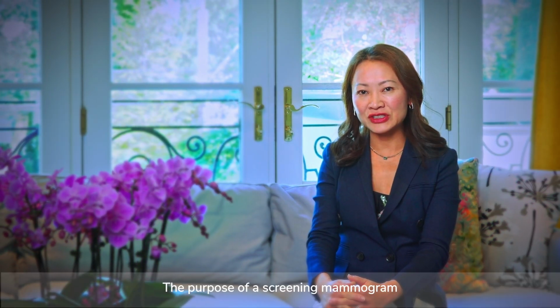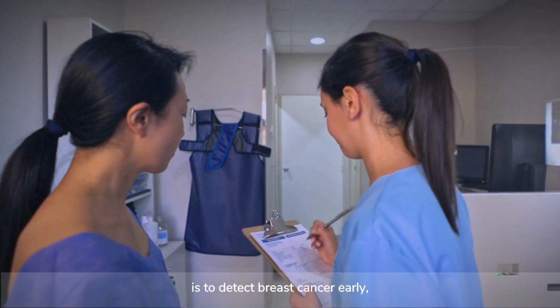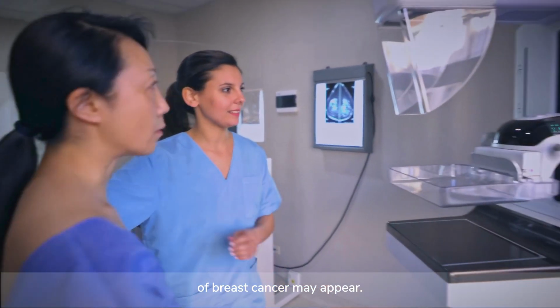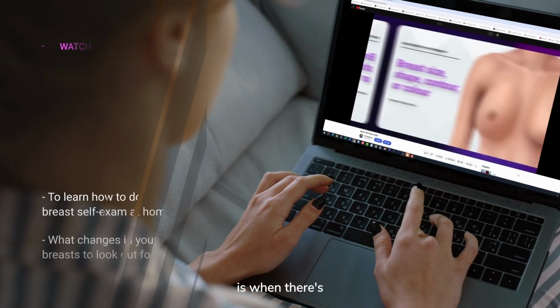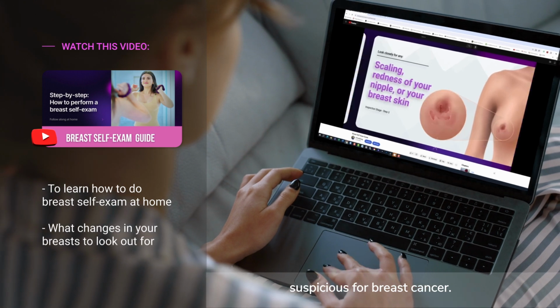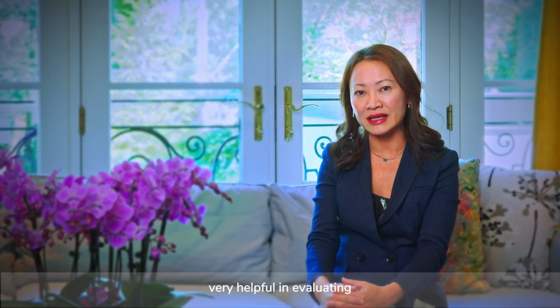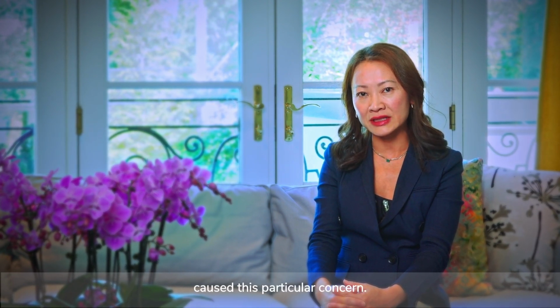The purpose of a screening mammogram is to detect breast cancer early, before any signs or symptoms of breast cancer may appear. The purpose of a diagnostic mammogram is when there's a specific sign that appears that may make you suspicious for breast cancer. A diagnostic mammogram is very helpful in evaluating to see what may have caused this particular concern.